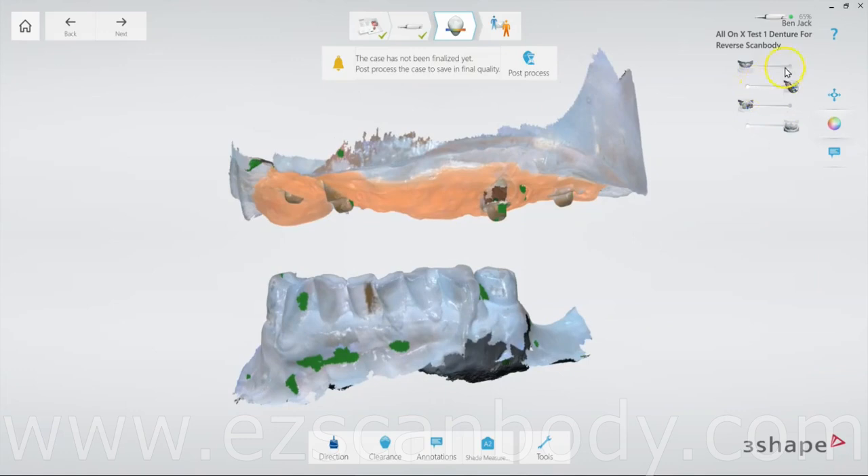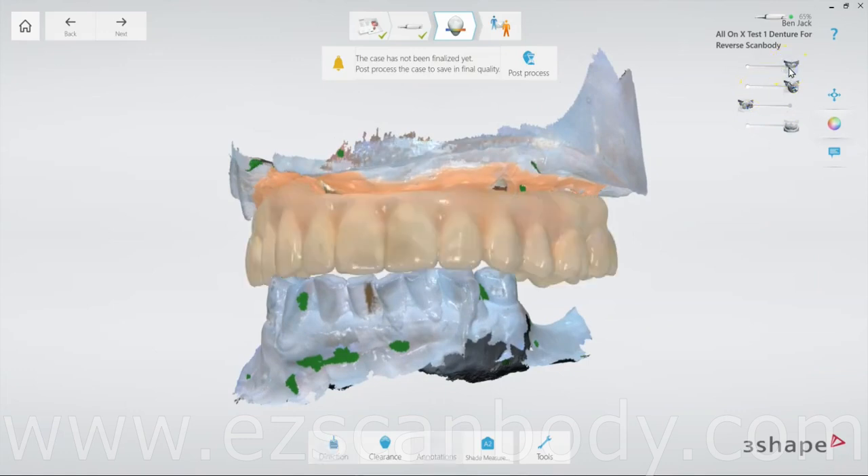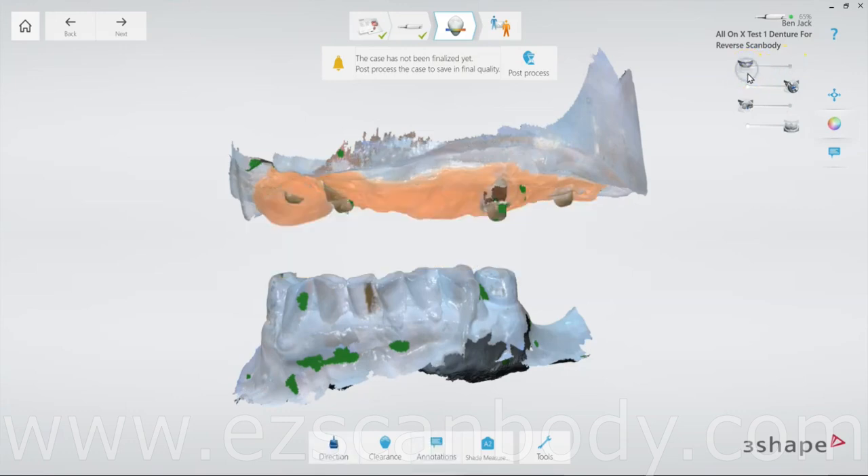As you can see, the upper edentulous jaw is aligned in the correct bite without the denture. We also have the denture and the H-Cap scan bodies ready for design.